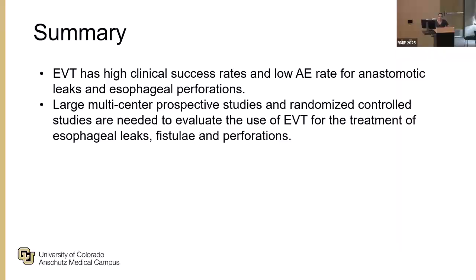So in summary, endoluminal vacuum therapy has high clinical success rates and low adverse event rate for anastomotic leaks and esophageal perforations. Large multi-center prospective studies, though, are needed, as well as randomized control studies to evaluate the use of EVT for the treatment of these esophageal defects.